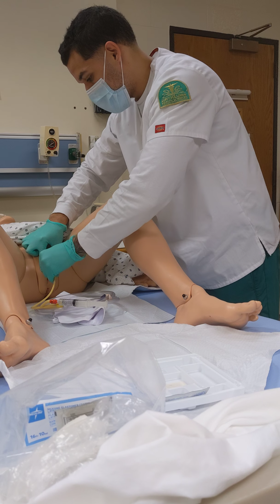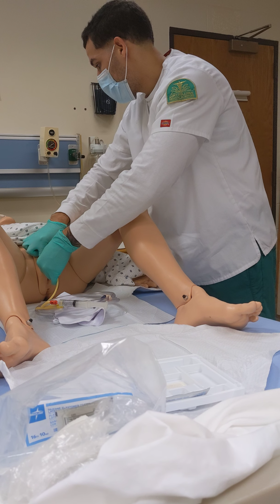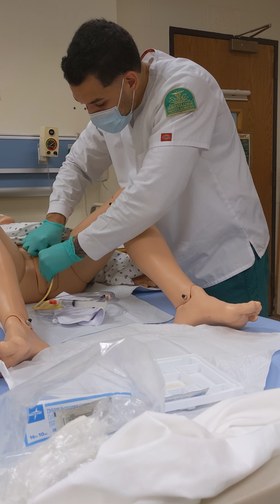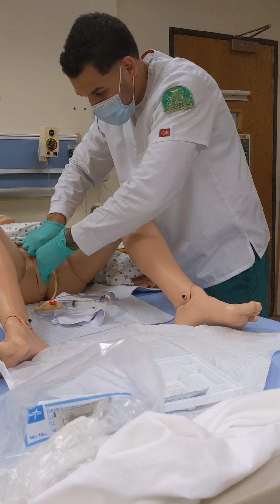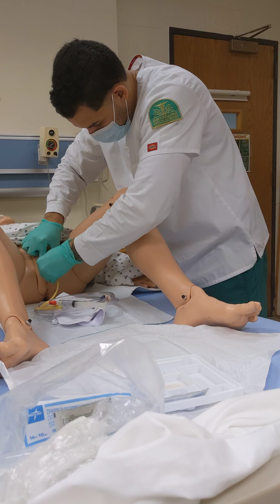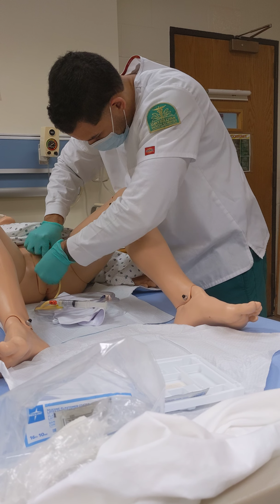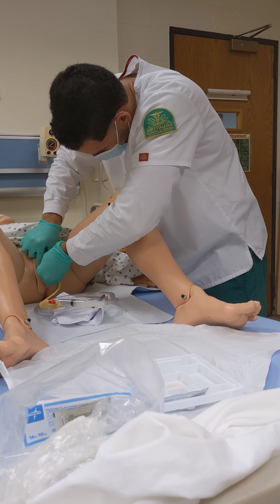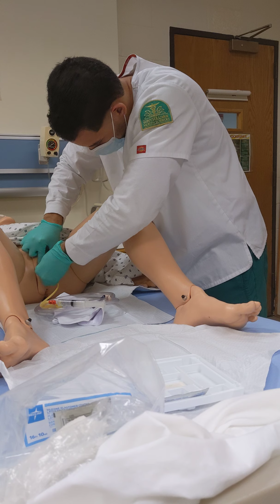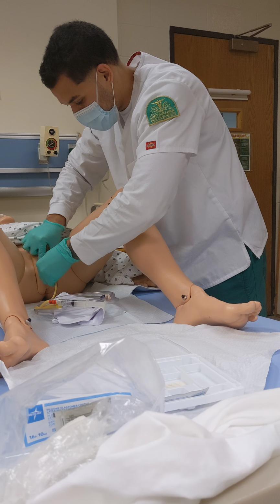Asking the patient and letting them know that they might feel some discomfort, but they should not feel pain, and to let me know if I need to stop if there's any issues. I will then begin to insert about 2 inches till I see a flash of urine. There's a flash of urine, and then I will insert an additional 2 inches.